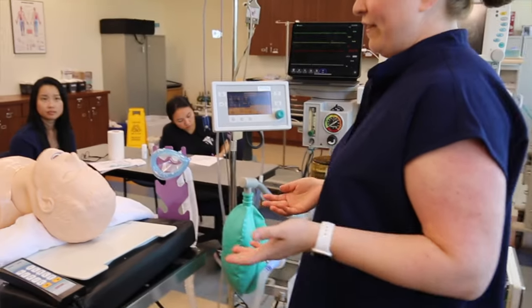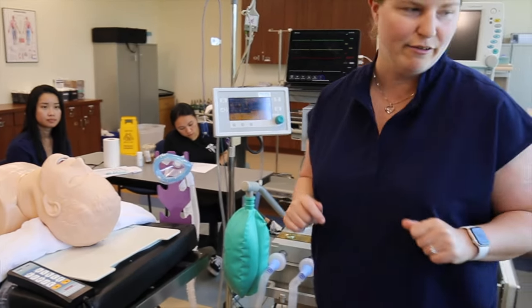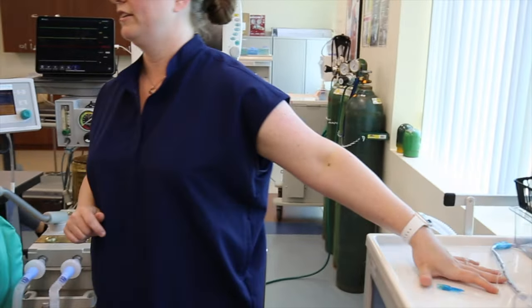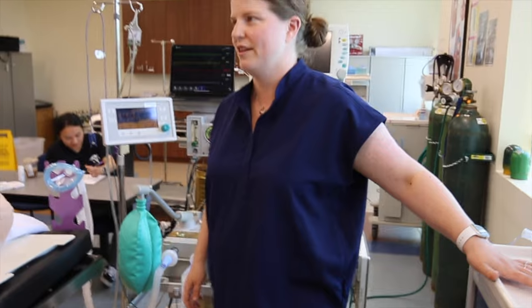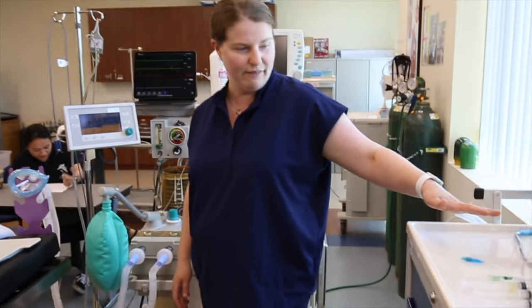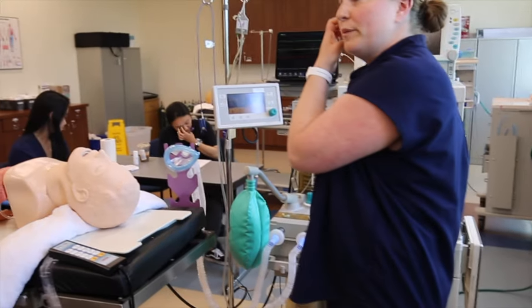And then E is everything else. So I have an OG tube, which I can't find. We used to have an OG tube. It's gone missing. Somebody OG'd themselves at home, I guess. So we have an OG tube, I have a bear hugger, and I have a peripheral nerve stimulator.